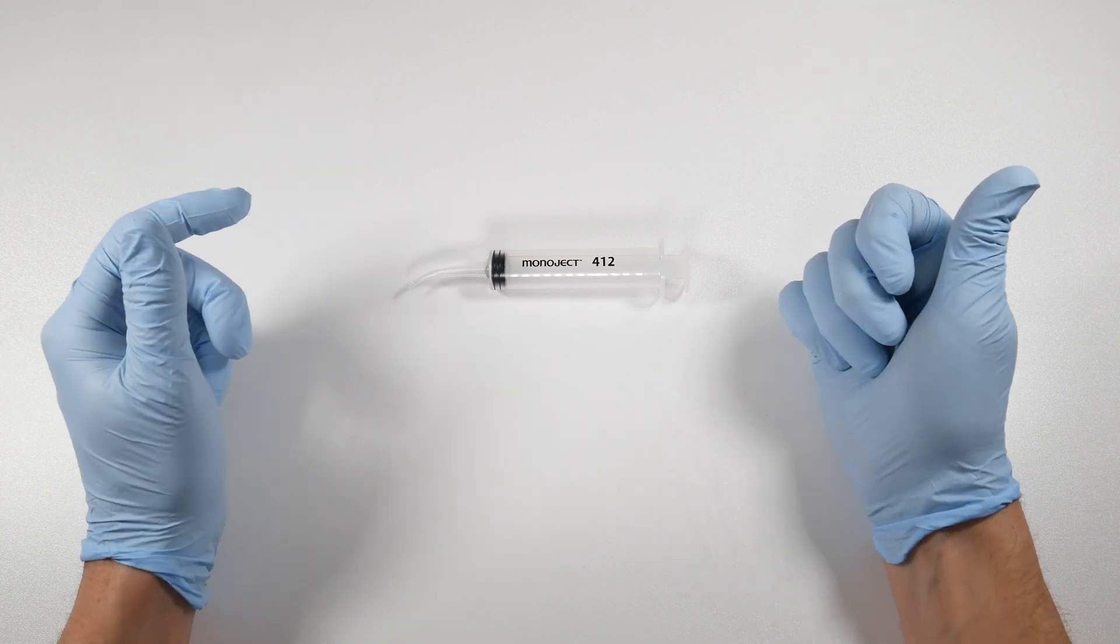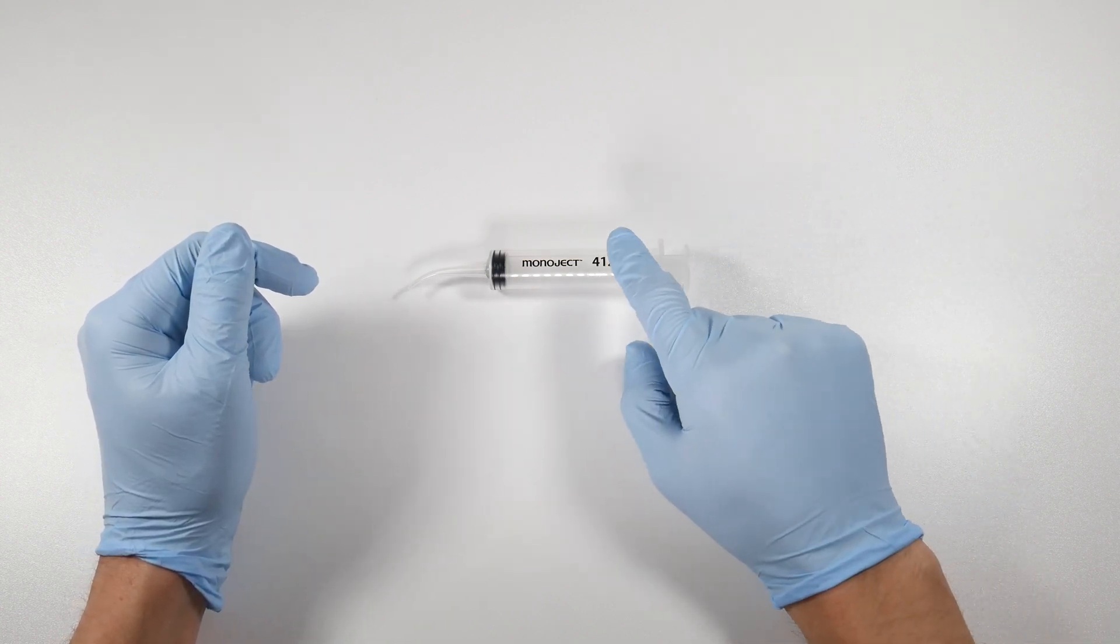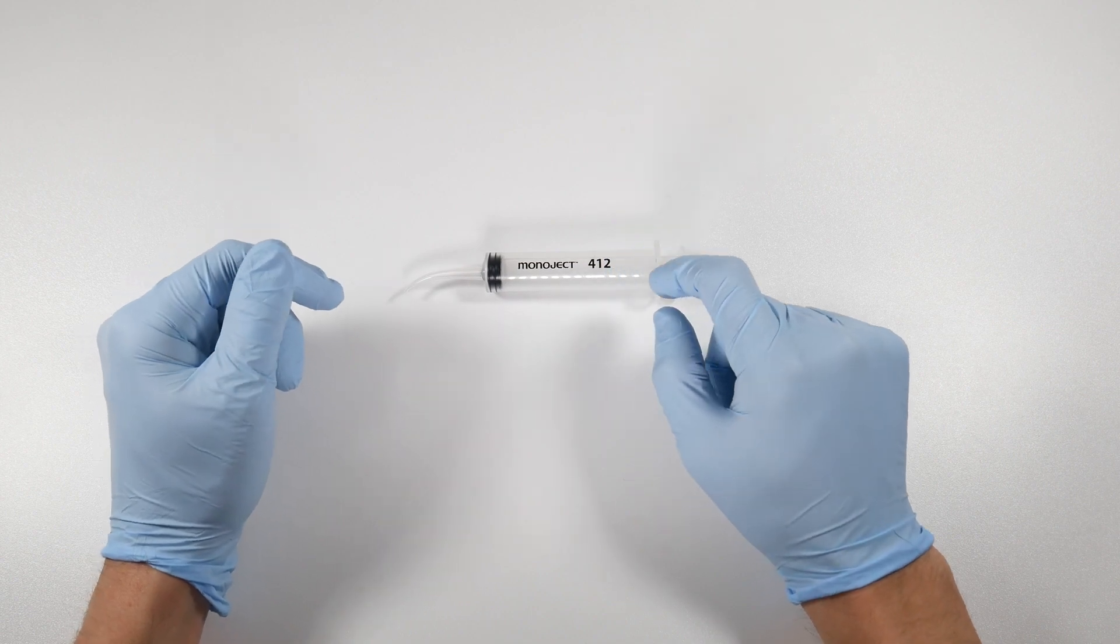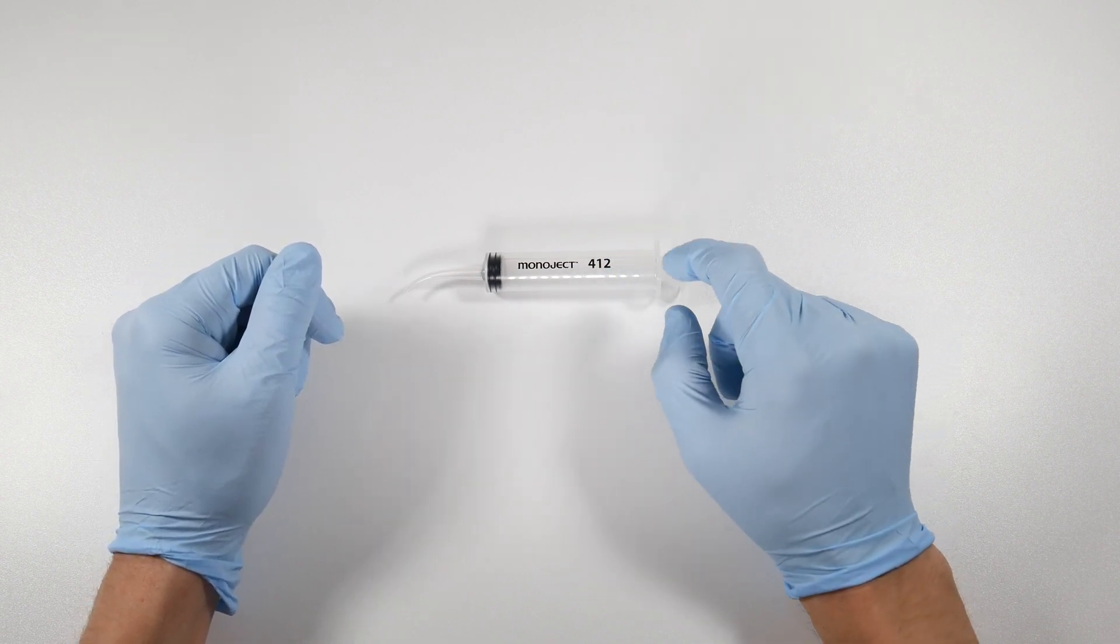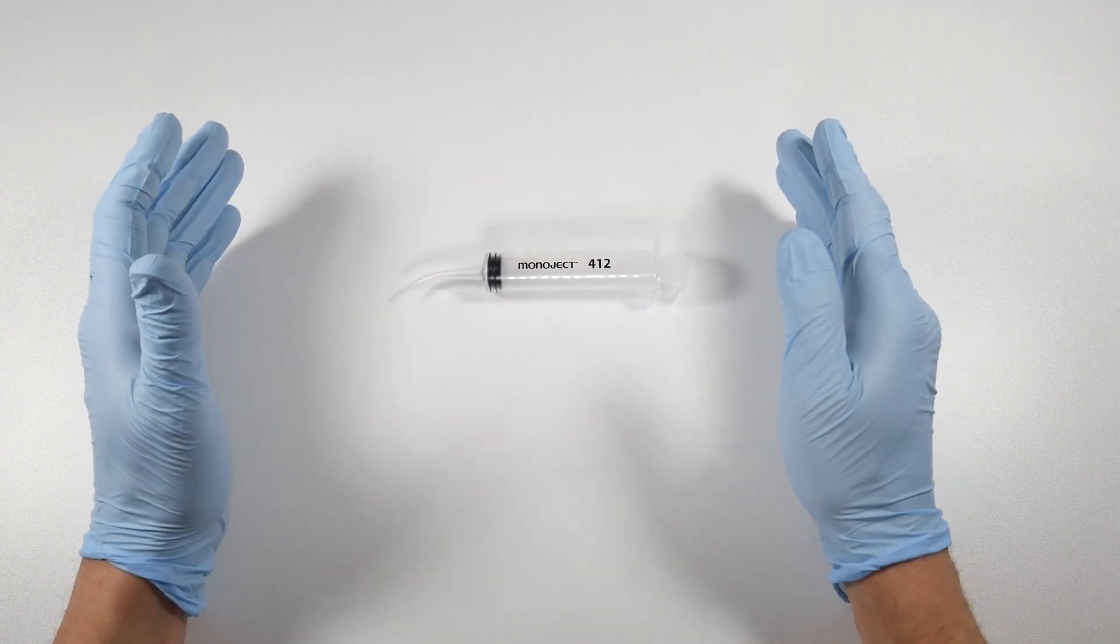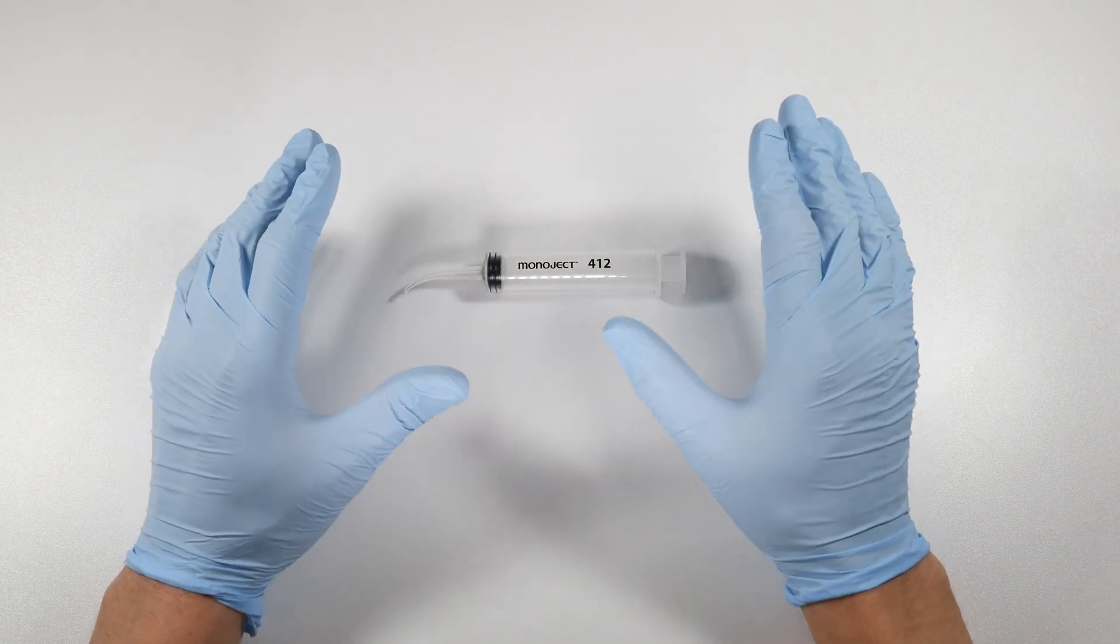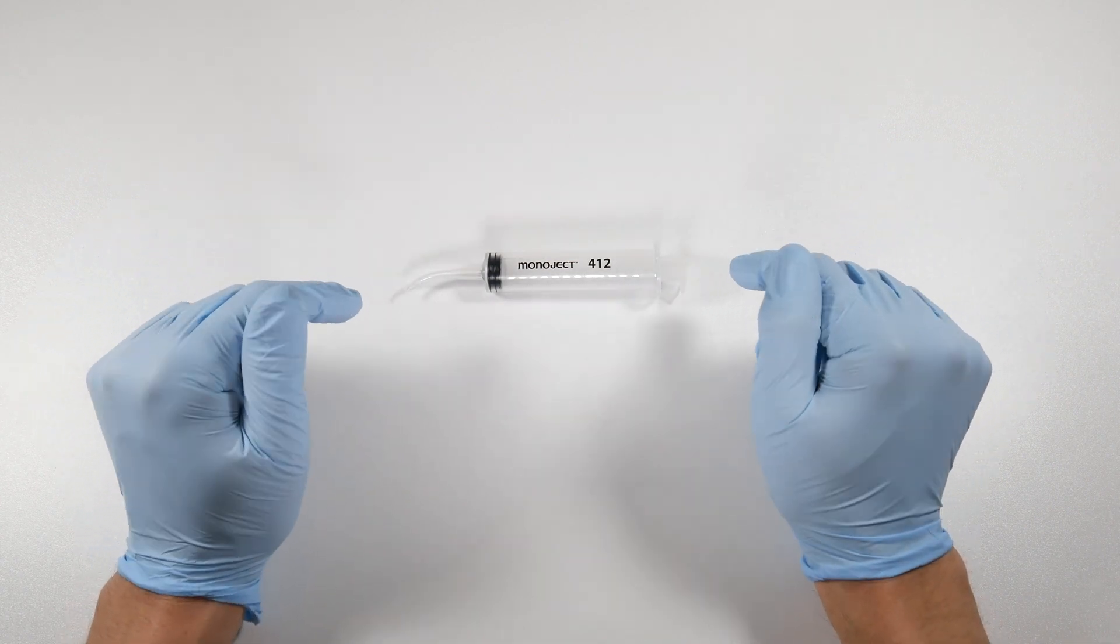If you're removing any other tooth and it's a simple extraction or surgical extraction, this in my opinion is sufficient for irrigating those sites. The reason I say that is that your flaps are usually not as extensive for those teeth and the amount of debris that you're creating is much less than say an impacted lower third molar.